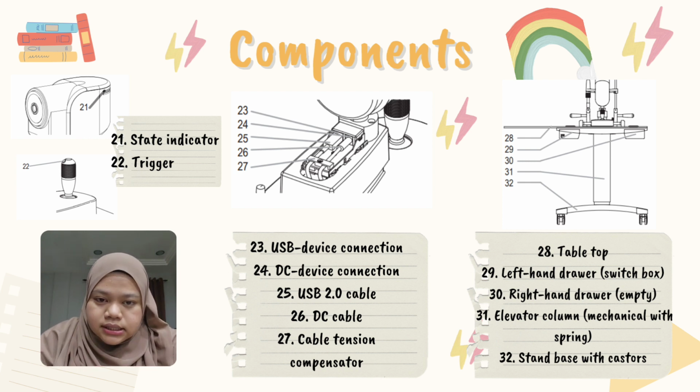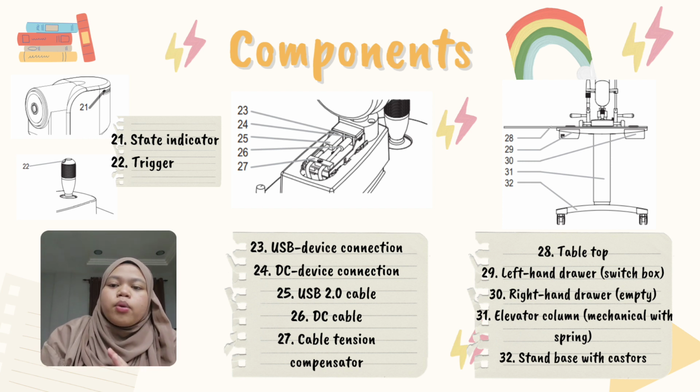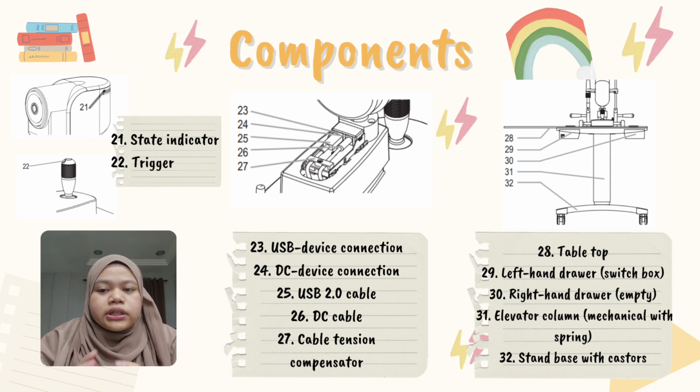And the last one is the 32nd component, which is the stand base with casters to move the instrument table around easily. That's all from me.